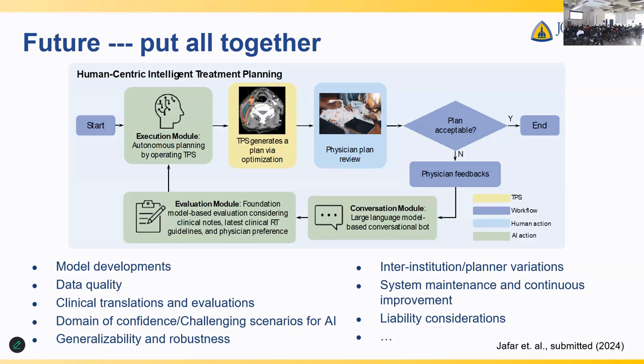For online treatment planning, for example, when the patient is on the couch waiting to be treated, we need to get the plan done in like two or three minutes. That's really the challenge. Not only the optimization part itself, but also all the planning decision-making part. But luckily for that, we do have prior knowledge, for example how this patient was treated the day before, and that already showed what a good plan should look like, and we have a lot to learn from there. I think by utilizing that kind of information, we can really speed up the treatment planning process. Thank you.